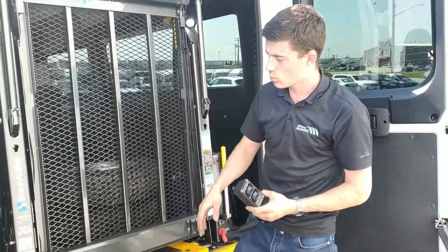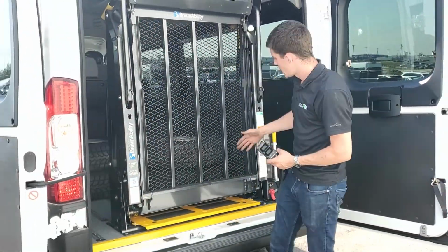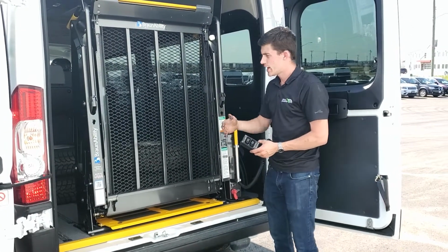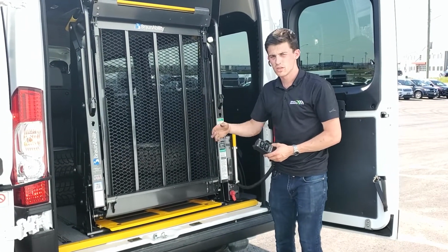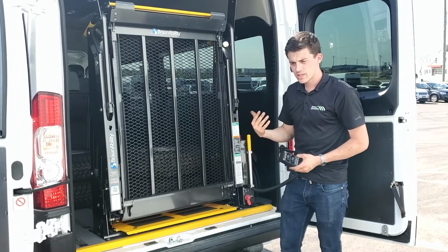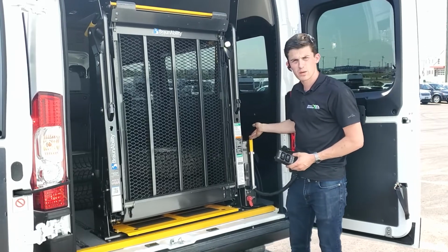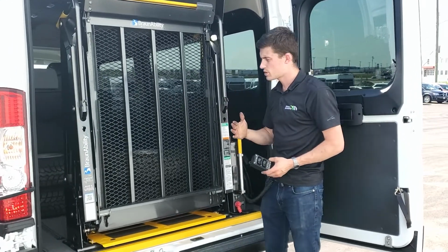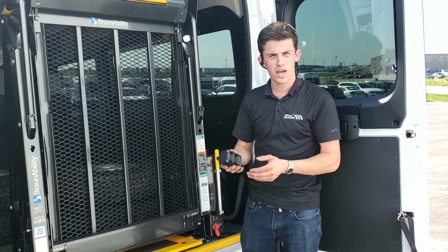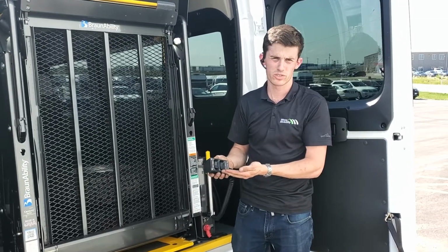And in the case of one of these hooks catching and the other side hasn't, it may stop the hand control from working and your lift will look twisted. And these upper lights may also go out. In that case, you will need to use the manual backup pump to pull the lift back into the vehicle to reset all the safety switches, and your hand control will light up again and you'll be able to use your lift.